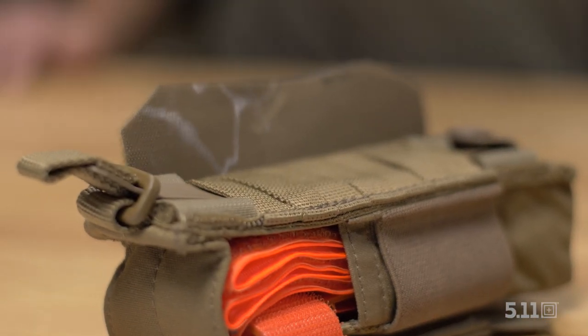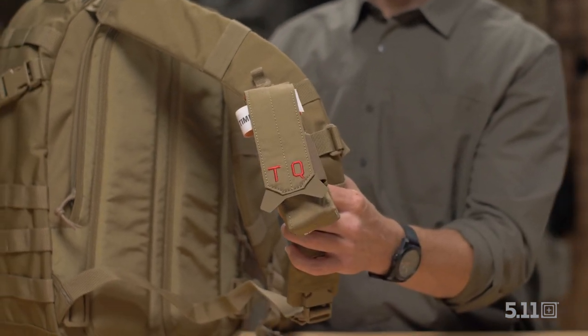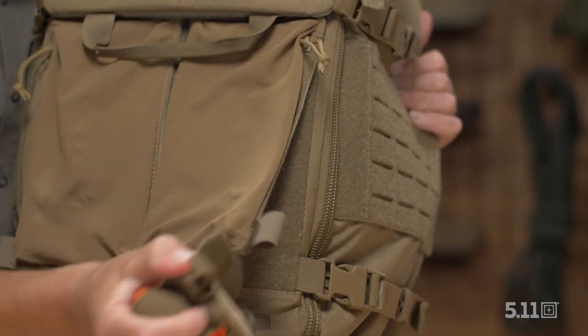We kept our design purposeful, functional, and convenient to give the user freedom for a variety of configurations. Stay in the fight and keep your tourniquet protected.